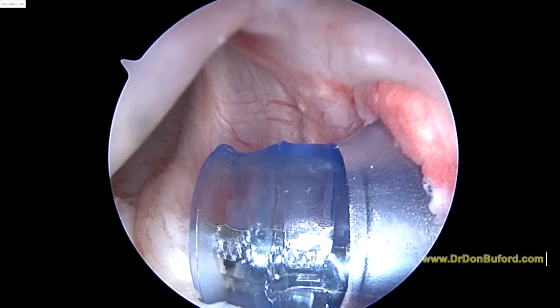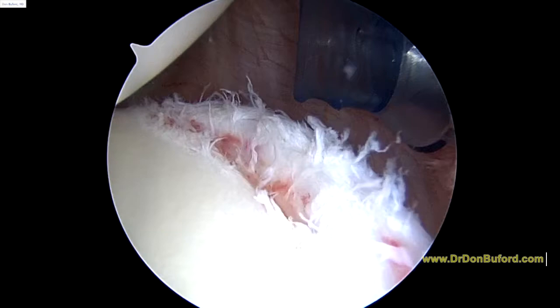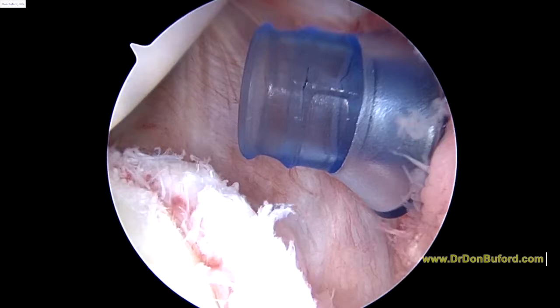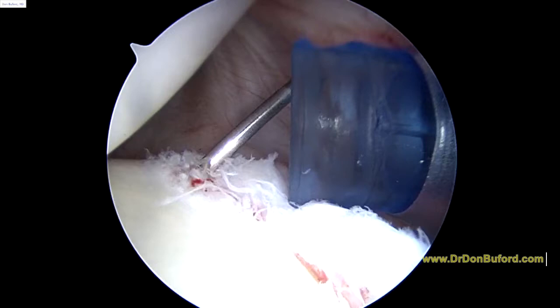When we bring the labrum up, you can see how that band gets developed, and that's what we need that ligament to look like. We're going to work on this just enough to create a healing response. So now we're going to take our spinal needle and check our angle to place the suture anchor in. We're going to start a little bit more inferior and bring that over a little bit — I think that's going to be a better angle.